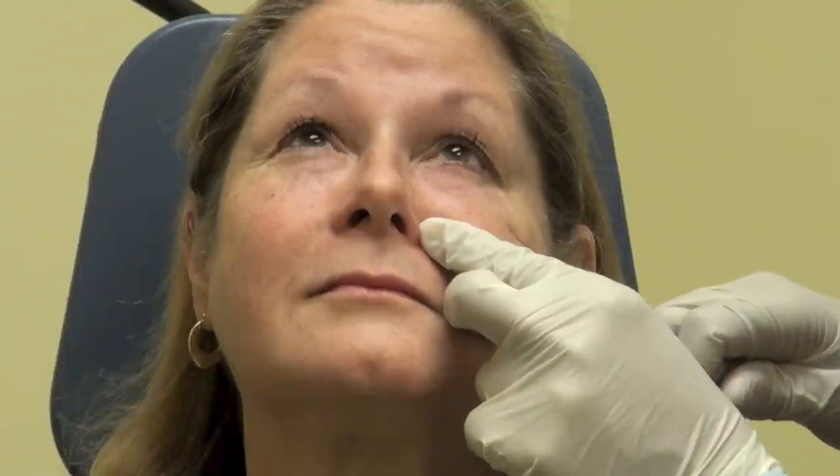99% done. Everything looks good. She still has a tiny bit of a bag showing on this side, not much. And that's what we talked about before — if you really want an A-plus result you'd have to buckle down and have surgery, but we can get a solid A with just the injectables.